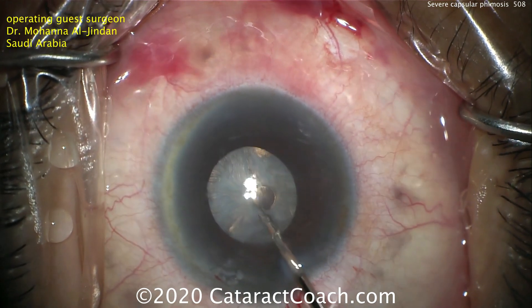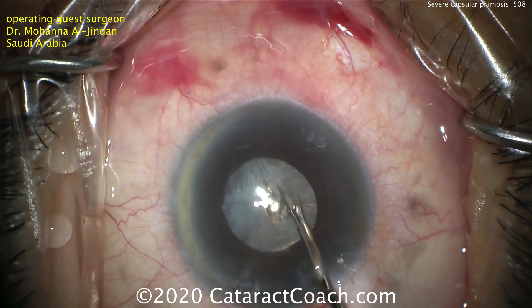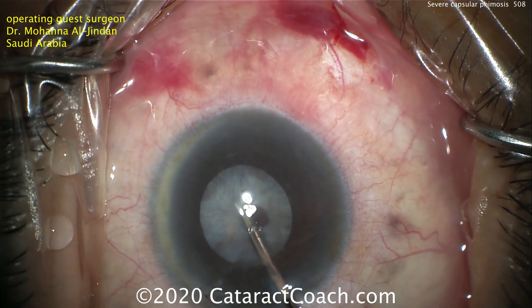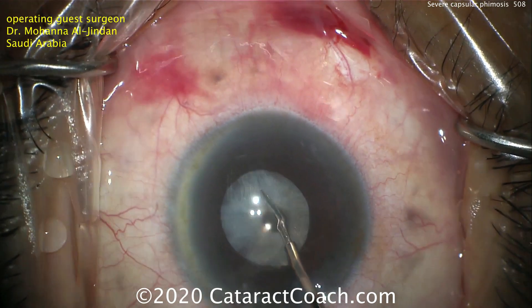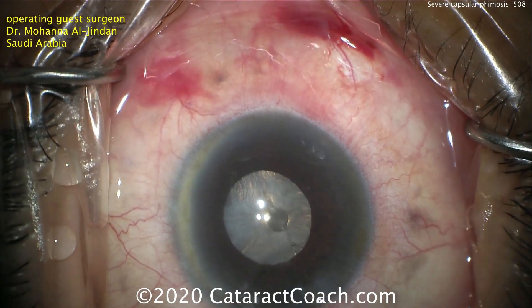You're also looking at the maximum pupil dilation. The micro scissors are being used to make a cut in that anterior capsular structure. Fortunately, the lens is very stable. There's not a lot of pseudophacodinesis. This eye IOL is really holding in place quite well.